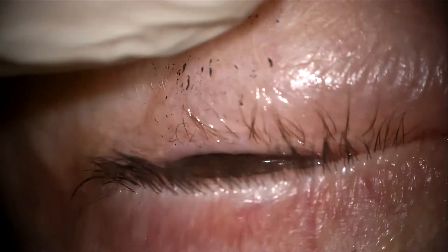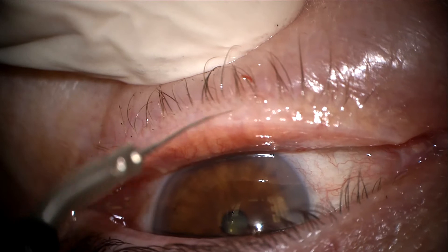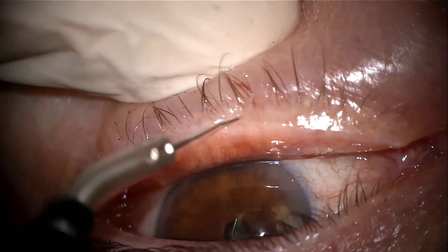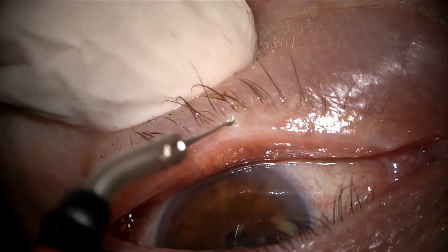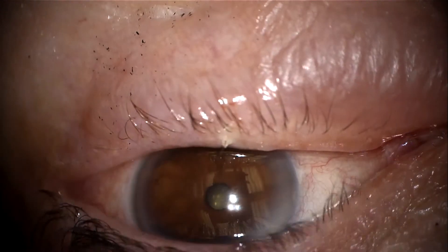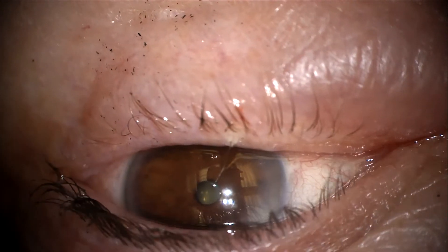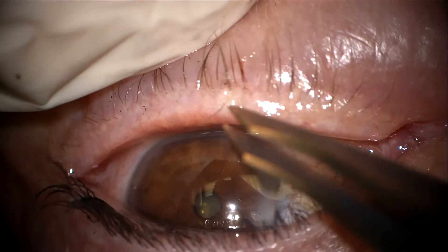It is important that the epilation needle is introduced into the eyelash parallel to the eyelash itself, so that you can reach the base of the eyelash at the follicle and then apply the energy until you see your reaction. Your endpoint is to be able to epilate the eyelash with minimal tension. If there is any tension, repeat the epilation energy, which I start off at five units.